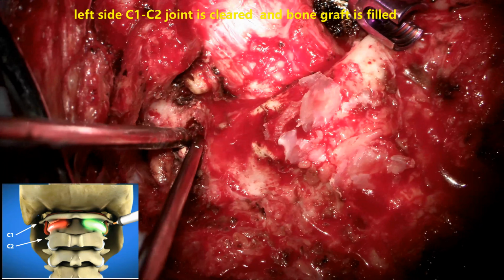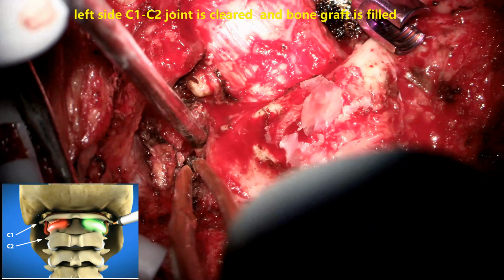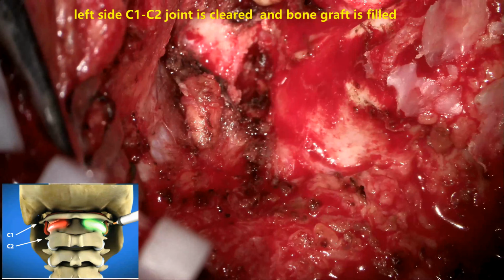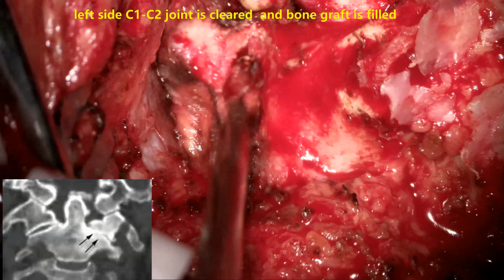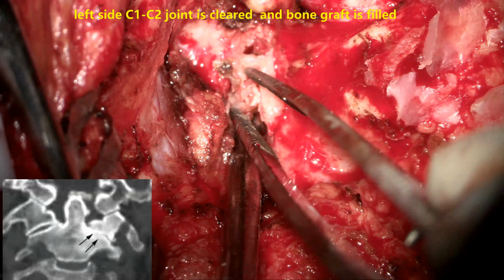Now we go on to the left side. Again, the joint space C1, C2 is prepared. Now I want you to see the wider joint space on the left side. You can see there, because of the asymmetric tilt, the C1, C2 on the left side is quite wide.